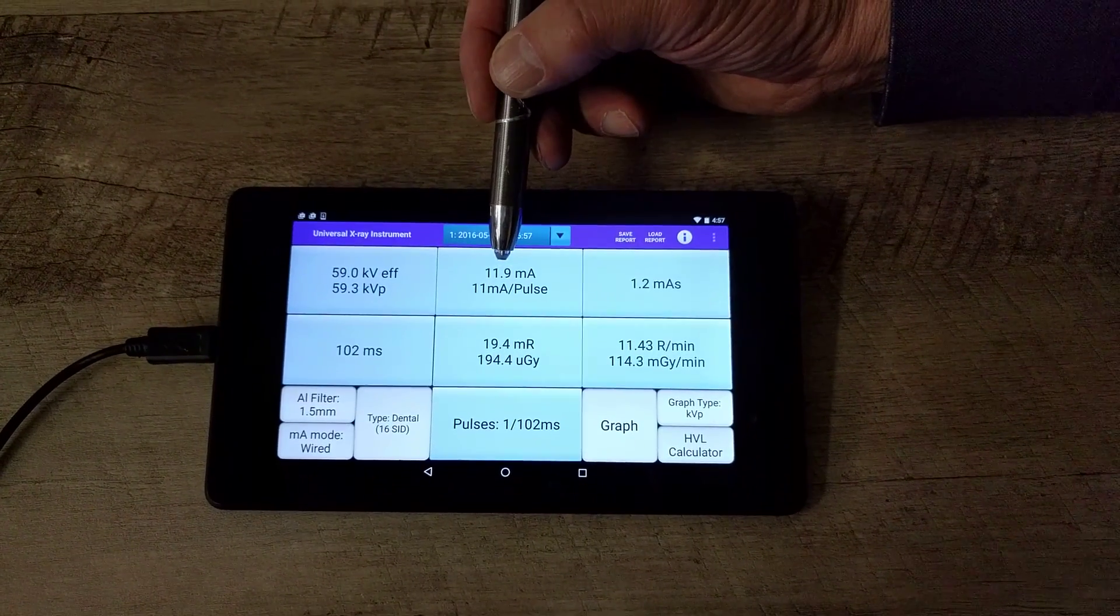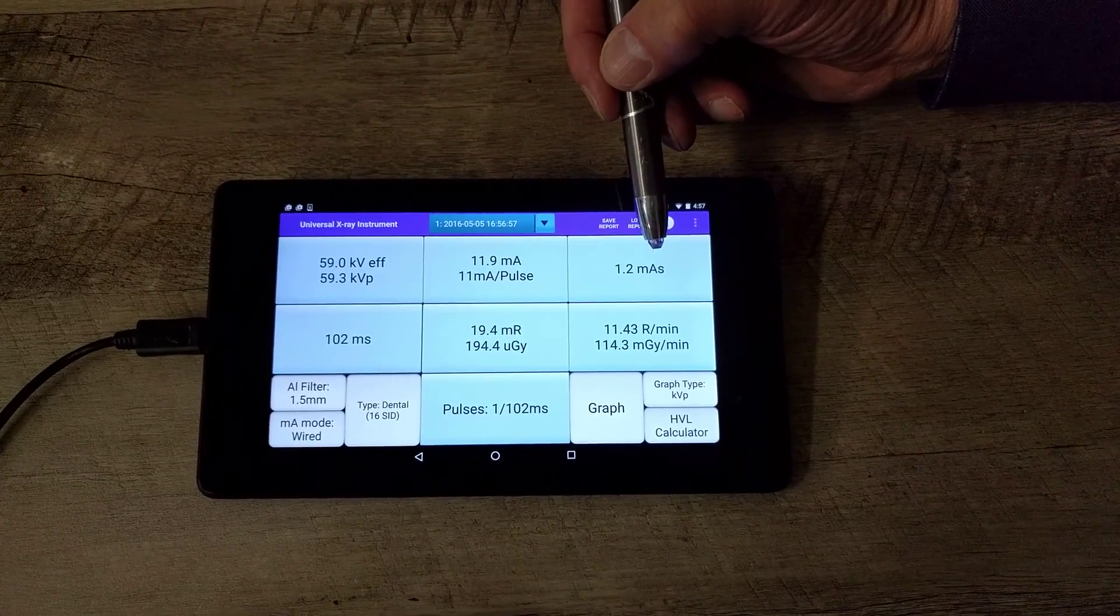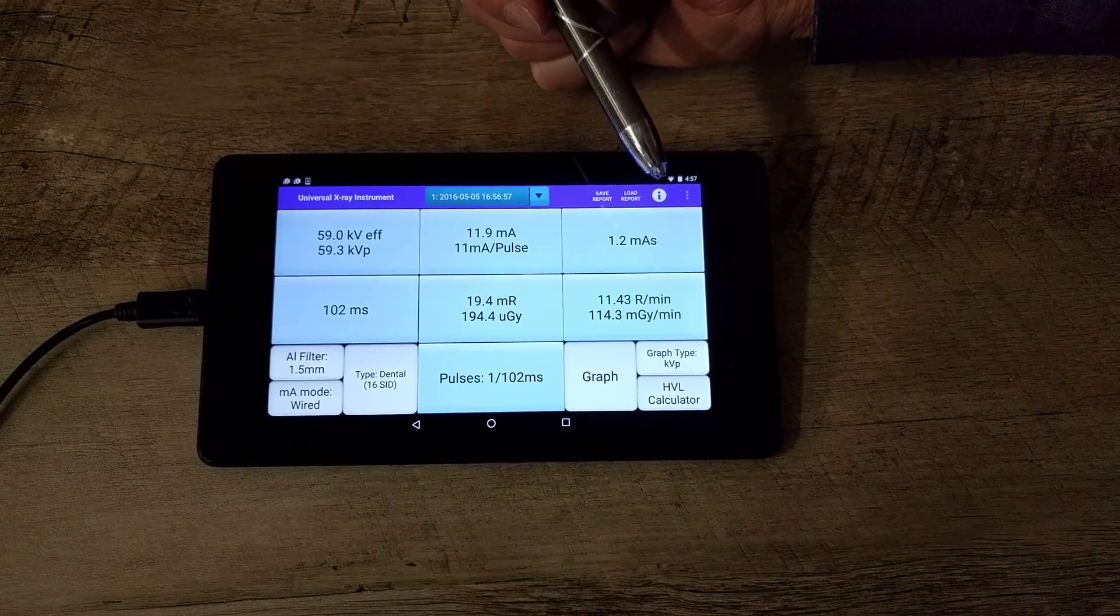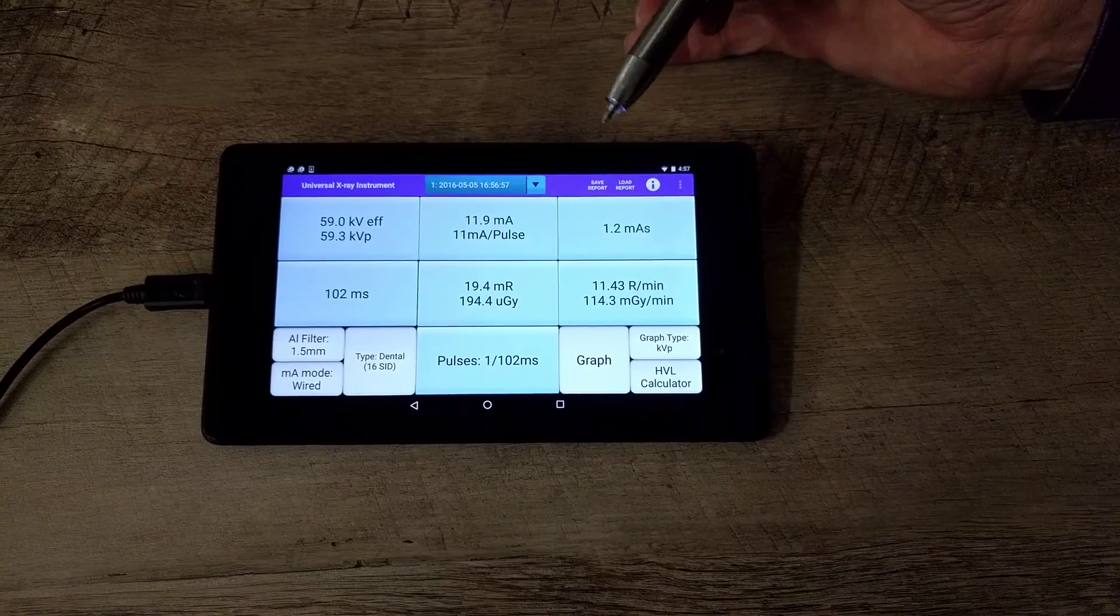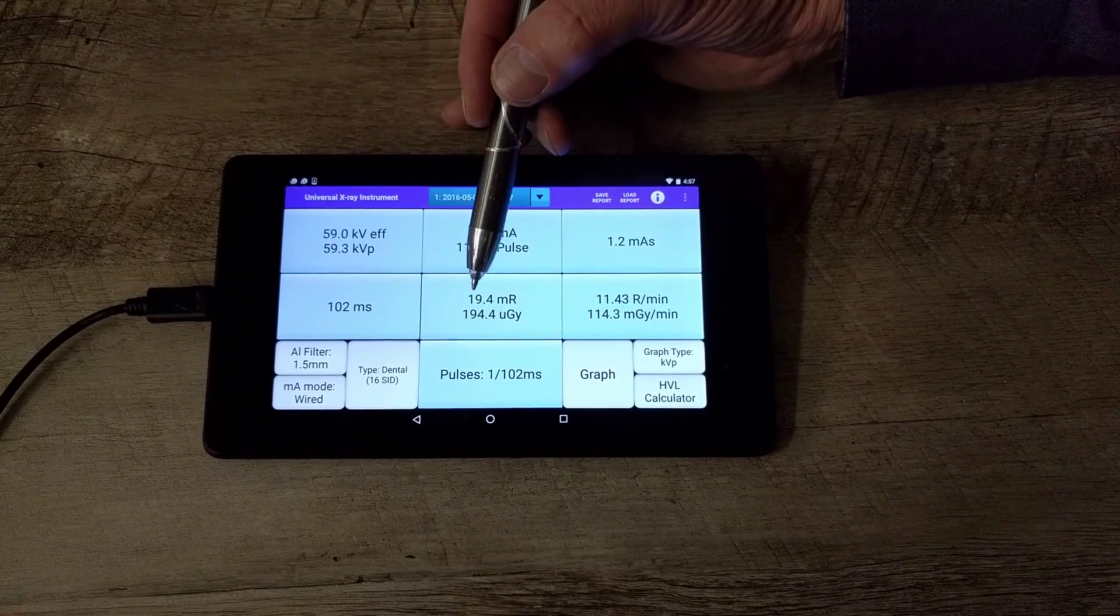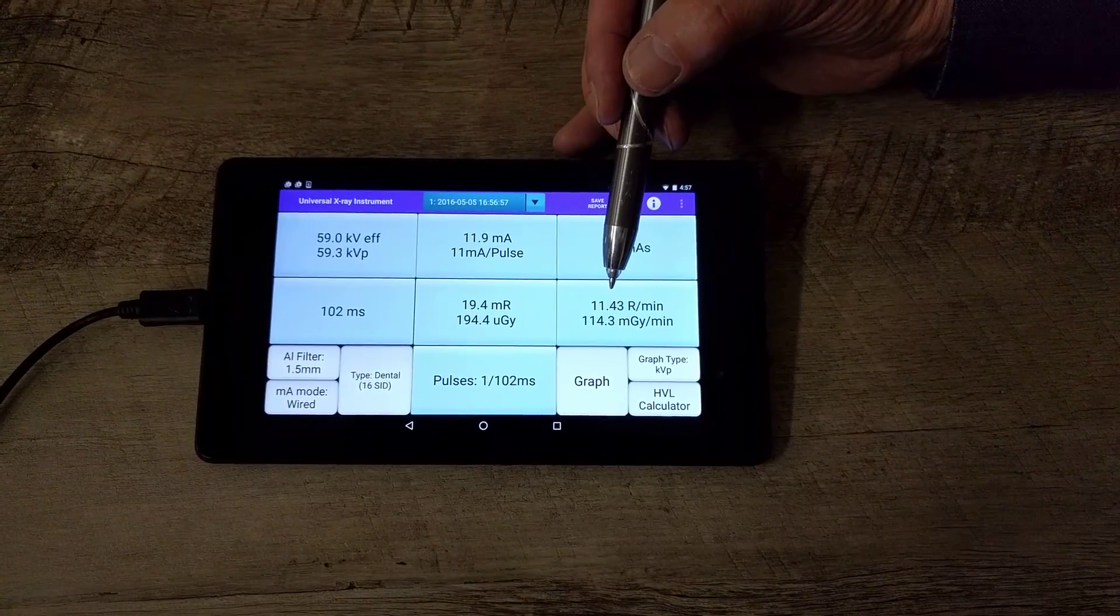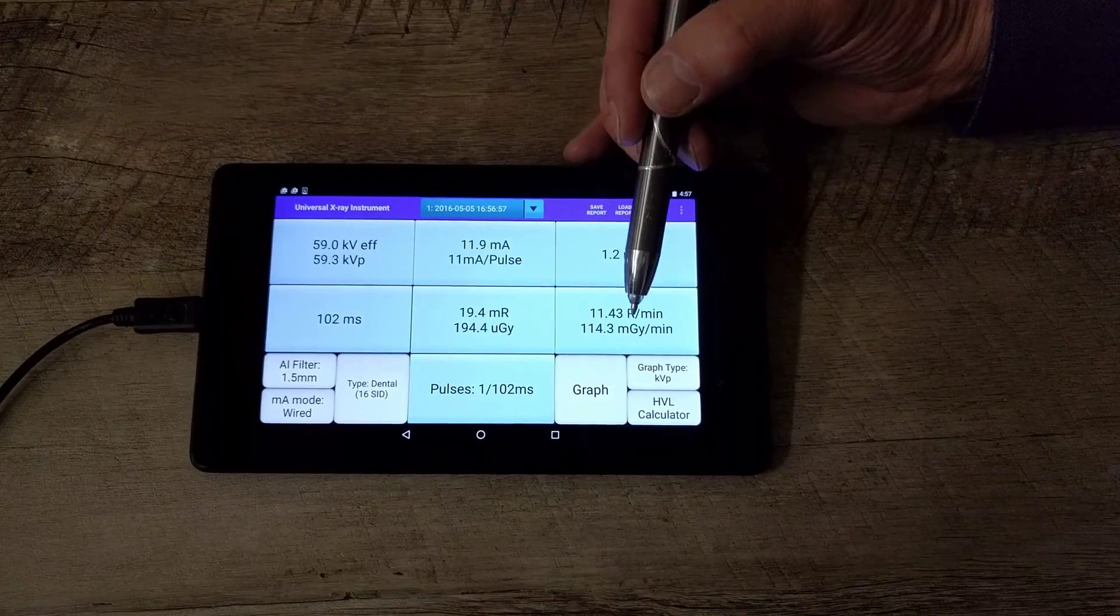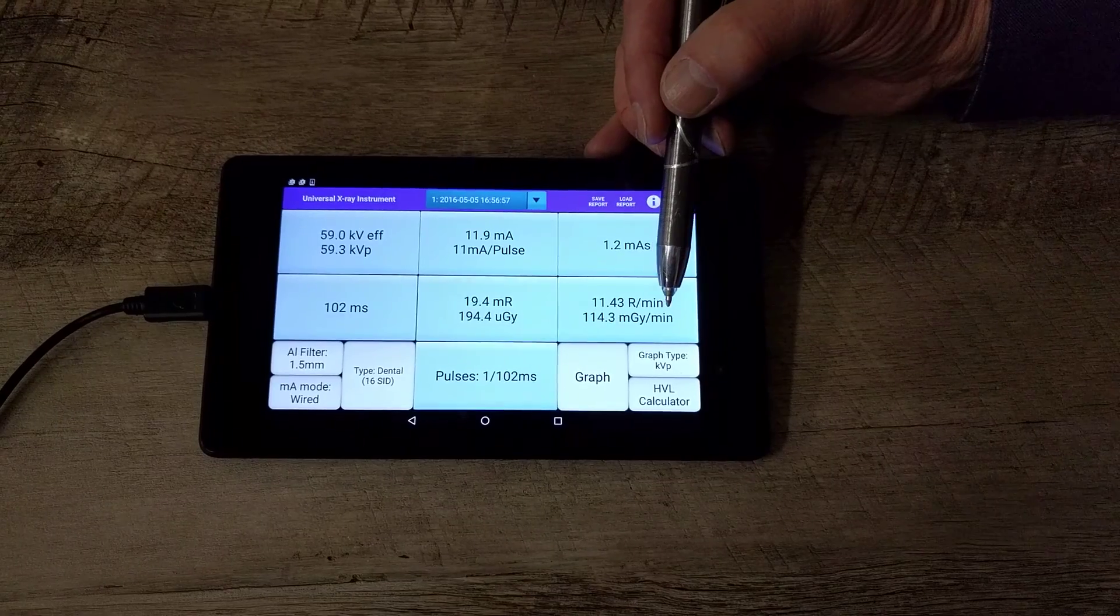Almost 12 milliamps, 1.2 mAs milliamp seconds, 100 milliseconds which is what the X-ray is set at. And here's your dose readings. We have dose both in metric and English: 19.4 millirads and 194.4 micrograys. We also have the dose rate that's in rads per minute or milligray per minute.